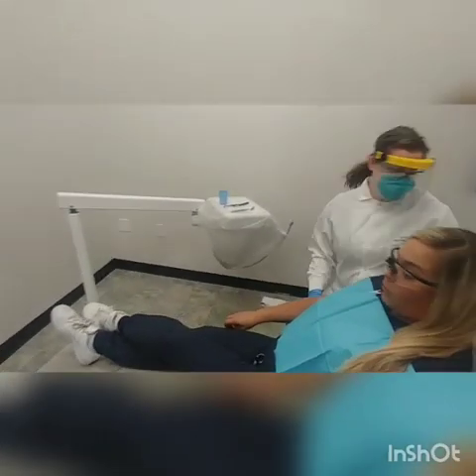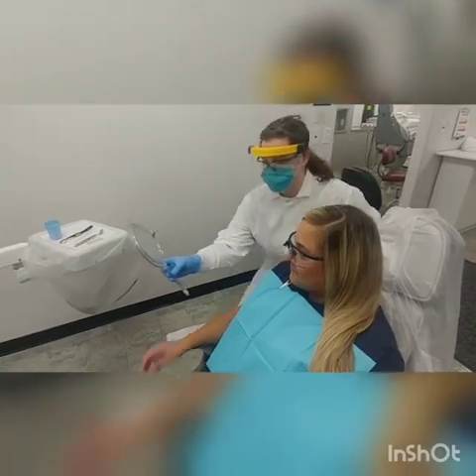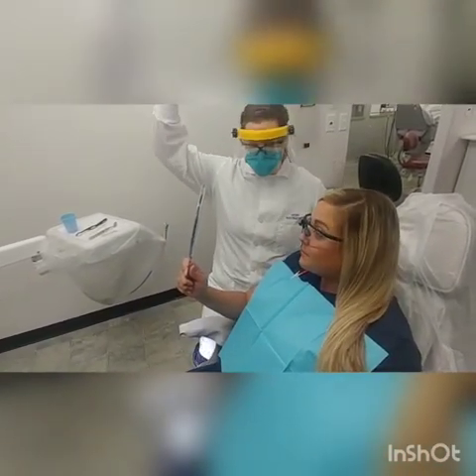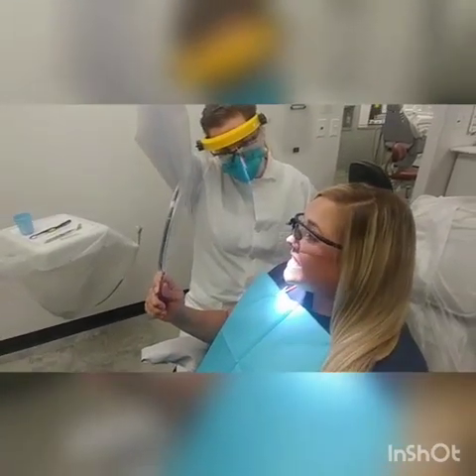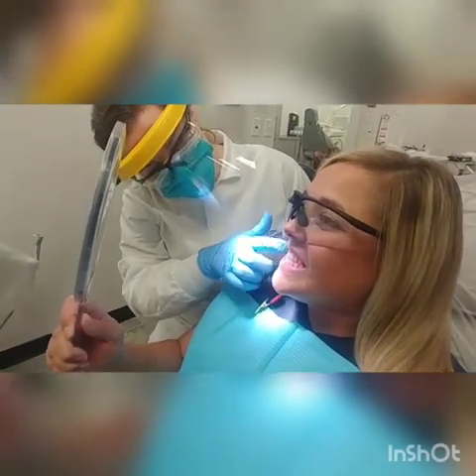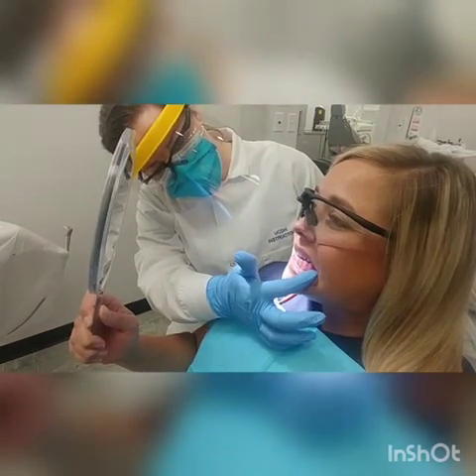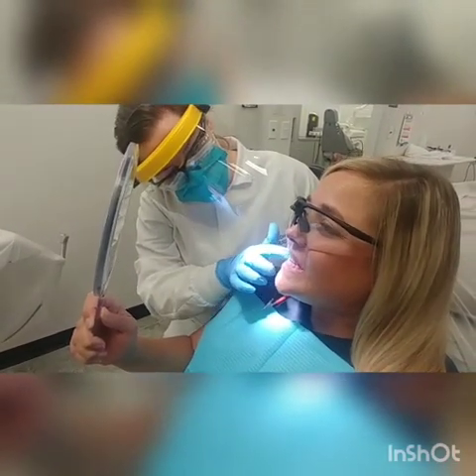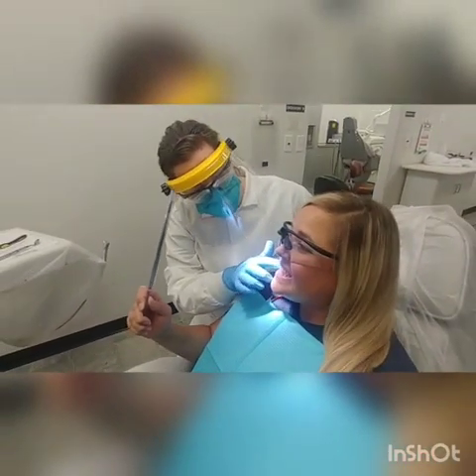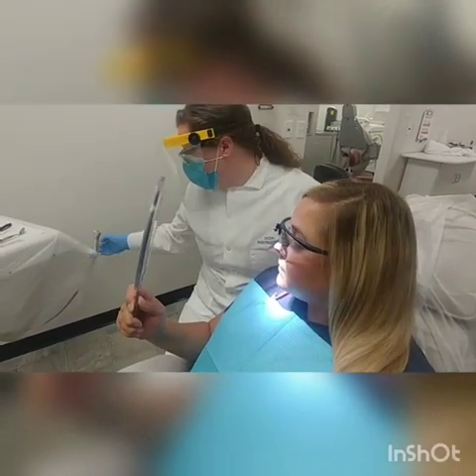Now that we have the percentage of the biofilm index, we're going to come back to our patient and we're going to discuss the findings with them. We're going to give them a mirror and show them exactly where we found the biofilm. Okay, so you can see, looks like you're brushing your top teeth really well. So you can see just a little bit heavier on these back bottom teeth on both the right and the left side. You see how it's just a little bit darker pink right along the gum line there? Yeah. So what that is indicating is that you've got a little bit more of that plaque biofilm that's just building up in those areas.